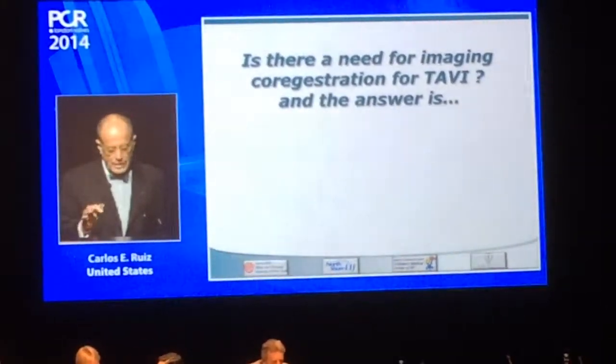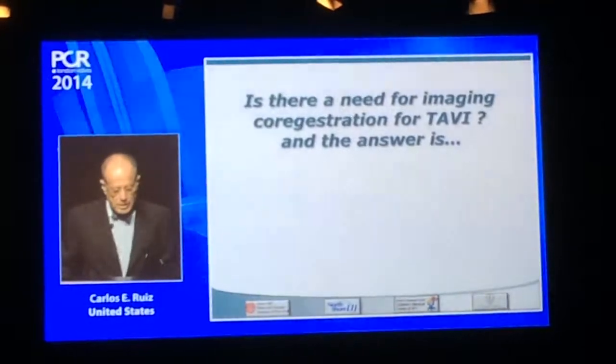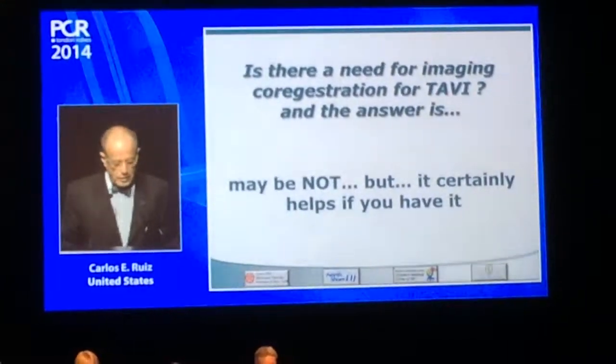So, in summary, is there a real need for imaging registration for TAVIs? The answer may be not in all the cases, but it certainly helps if you have that.